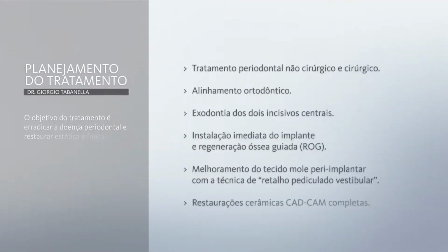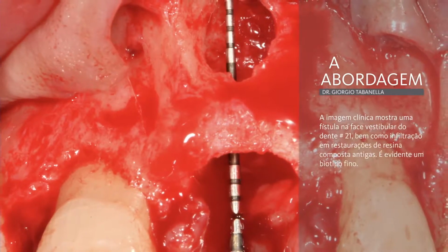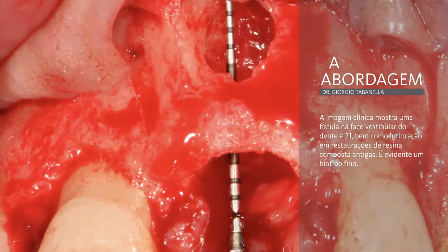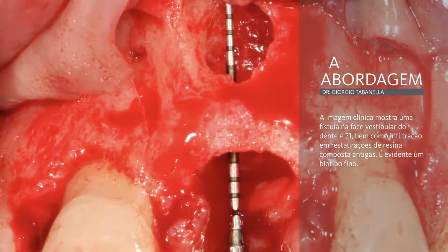First, we need to eradicate periodontal disease. Then we're going to perform orthodontic realignment, extraction of both central incisors, immediate implant placement, and then we're going to boost the peri-implant mucosa by using the buccal pedicle flap. This is at the time of immediate extraction placement and simultaneous guided bone regeneration to correct the fenestration, to repair the fenestration, and also to create a buccal bone balcony.